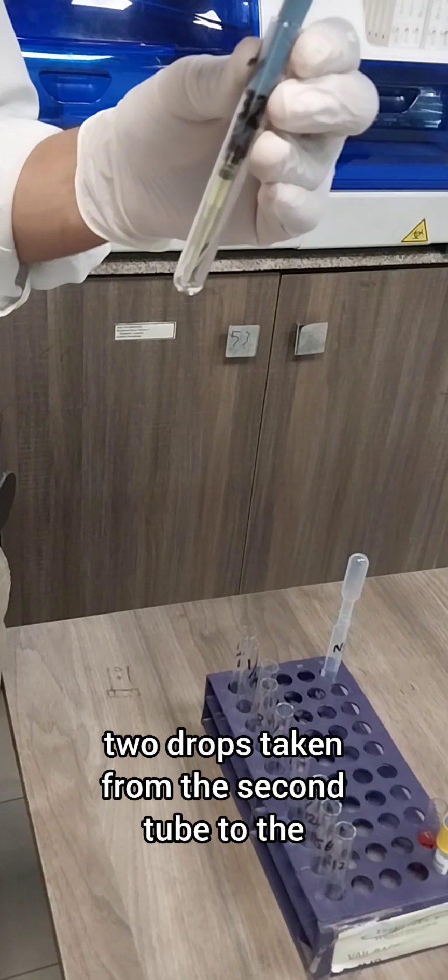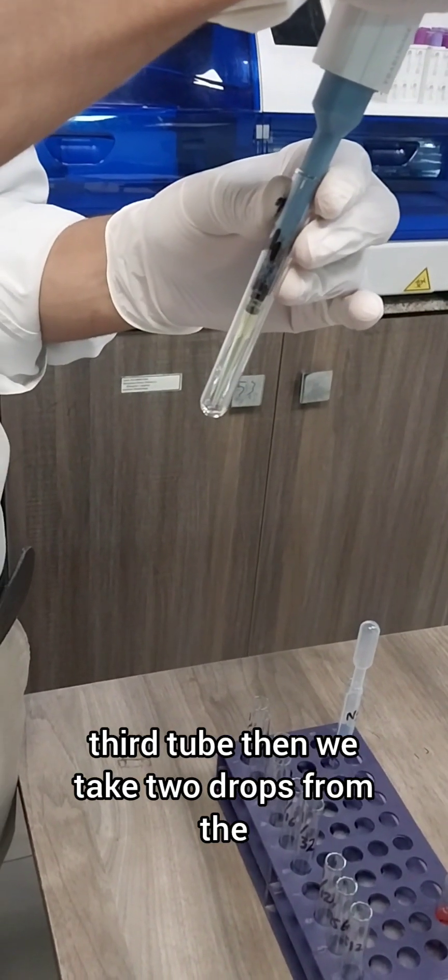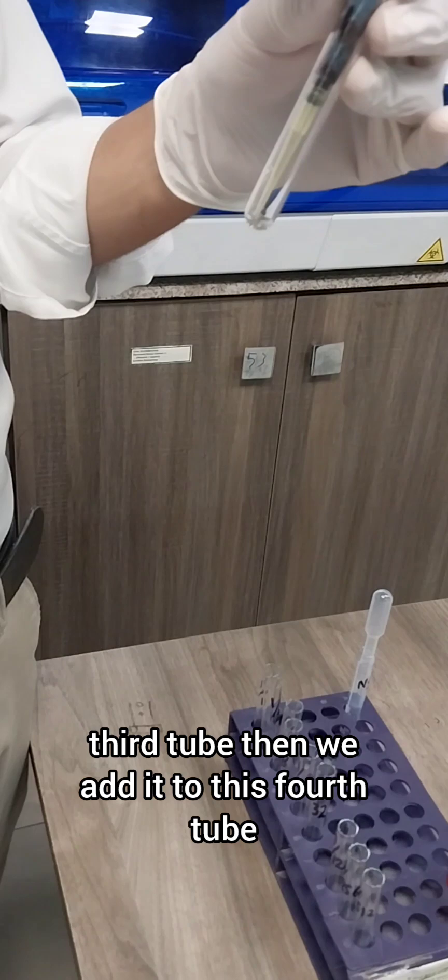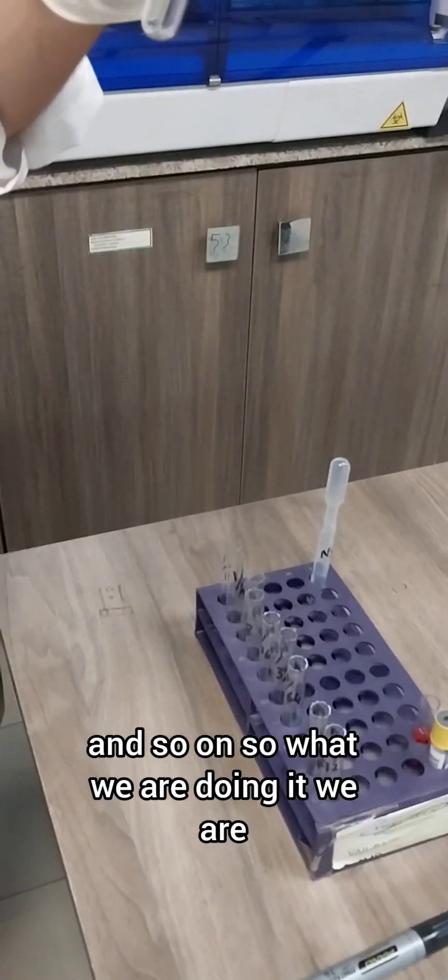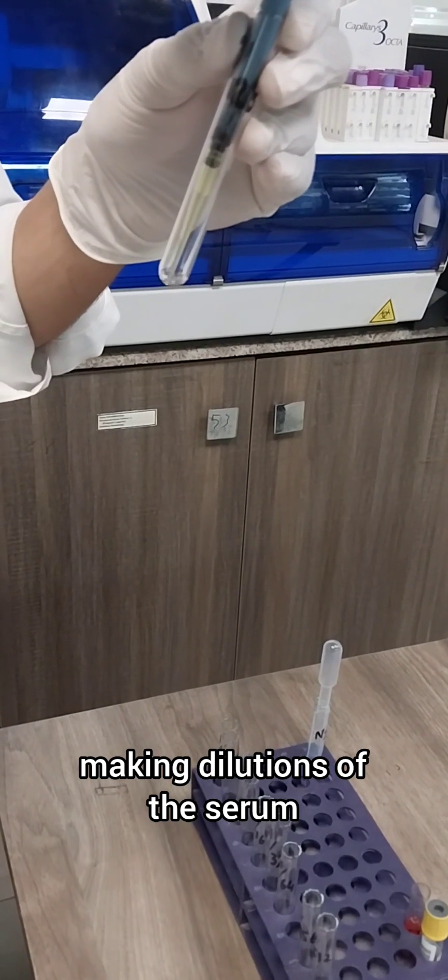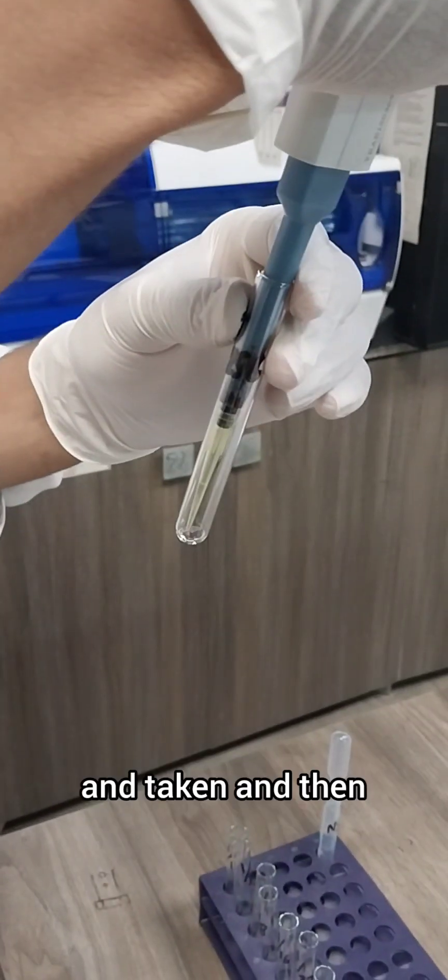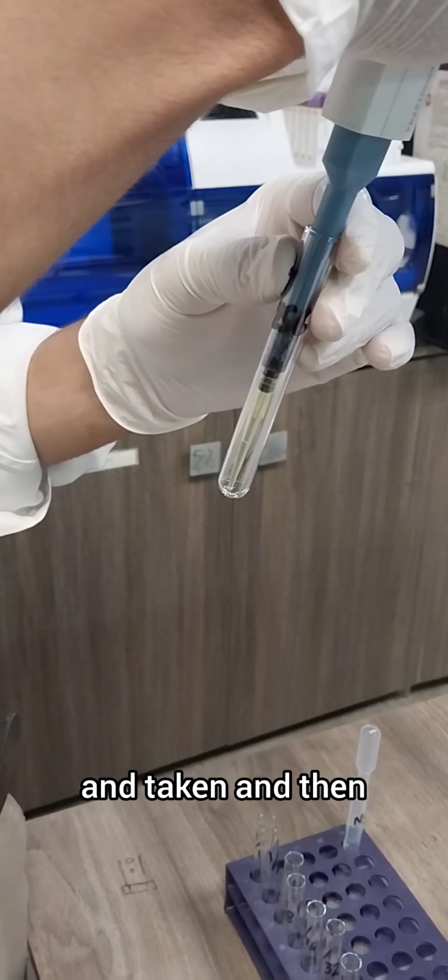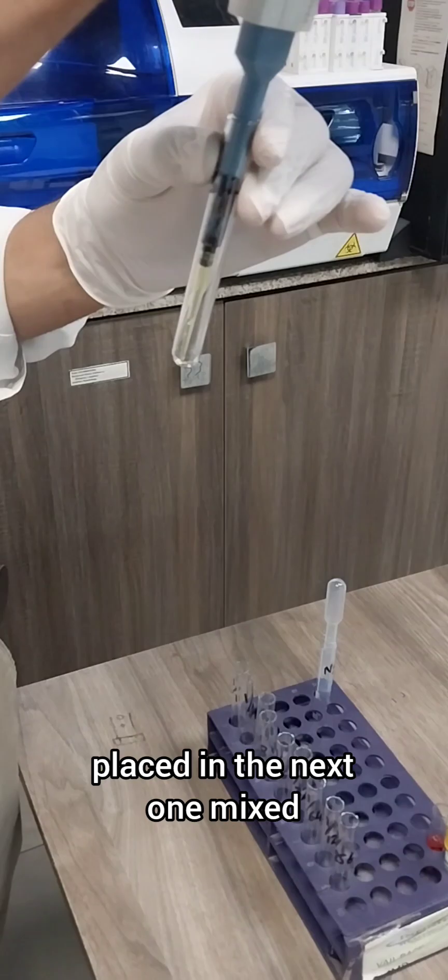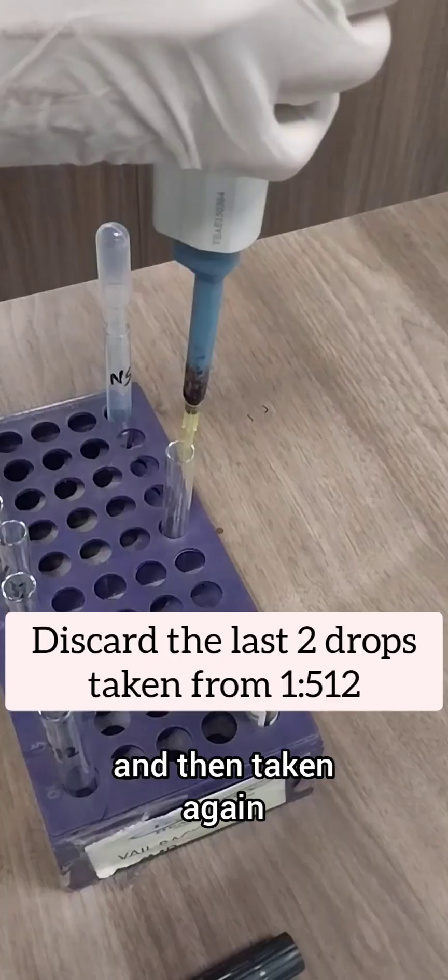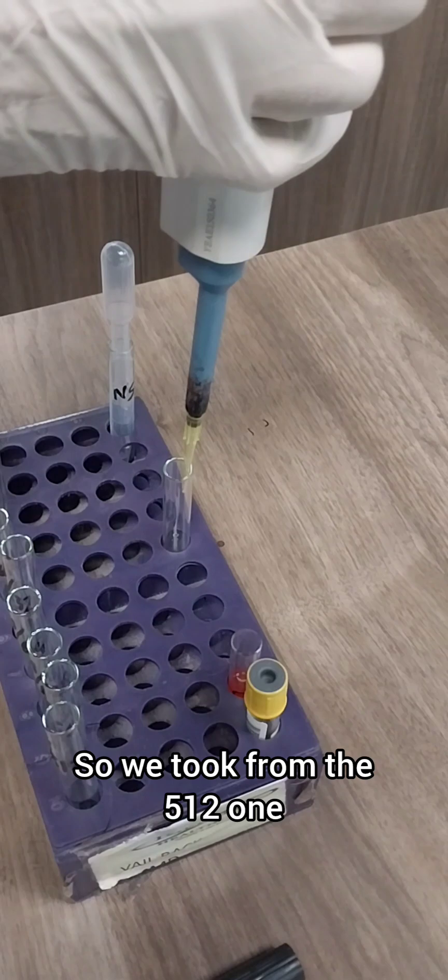From the next tube onwards, we are just going to transfer two drops taken from the second tube to the third tube, then we take two drops from the third tube and add it to the fourth tube, and so on. We are making dilutions of the serum. You can see we are using a pipette, taken and placed in the next one, mixed and then taken again. We discard the last two drops from the 512 tube.